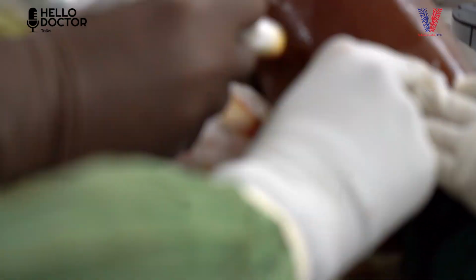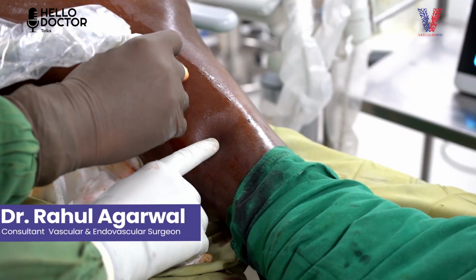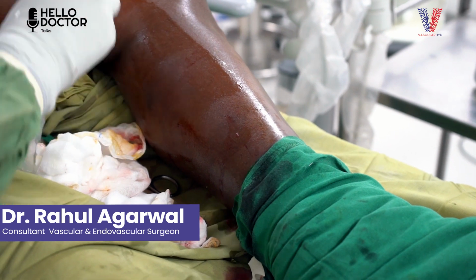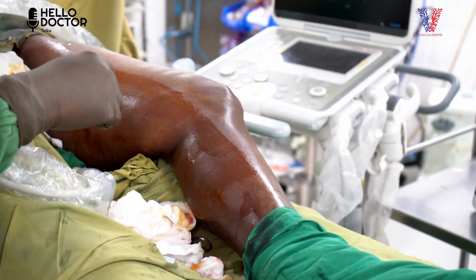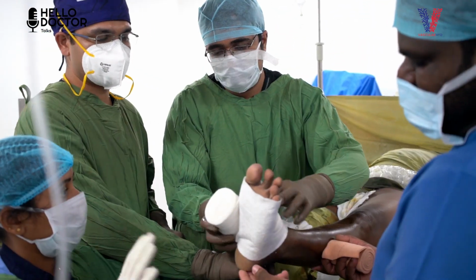And now you can focus here. This was our access site. Now it's like a pinhole, so there is no scar post surgery, and for all the small needle pricks that were given, there will be no scar. So this is a completely scarless procedure for varicose veins, that is endovenous laser ablation.